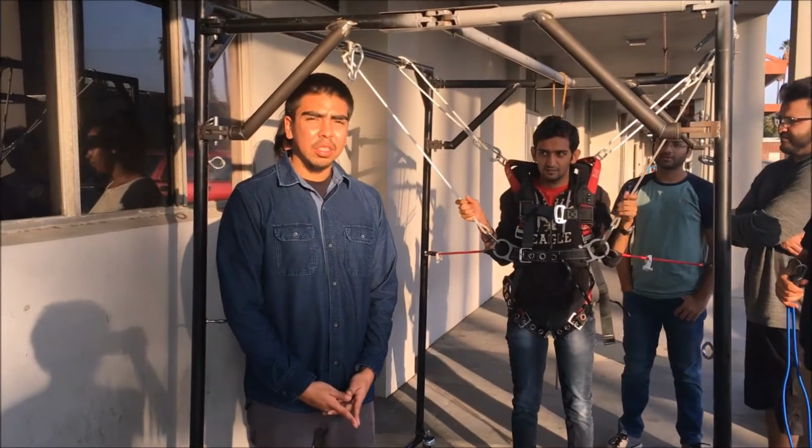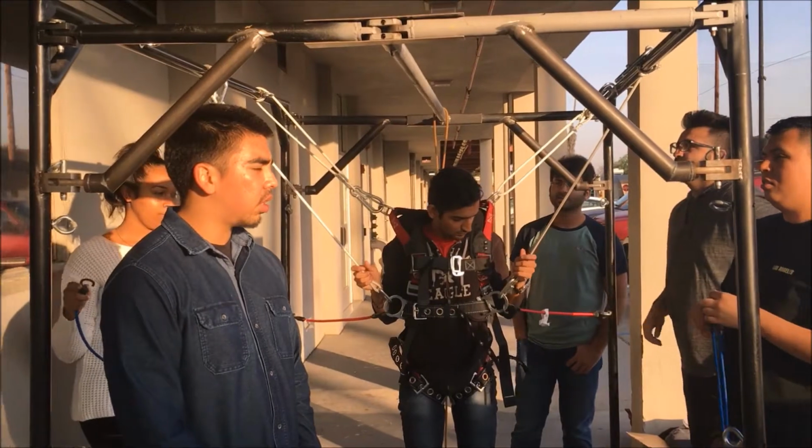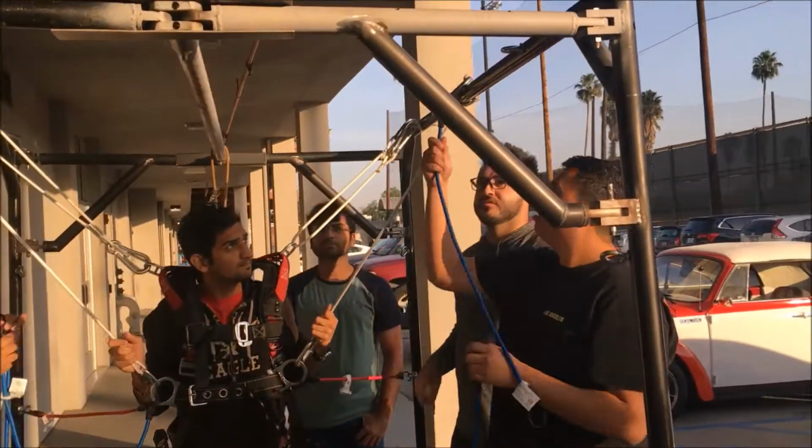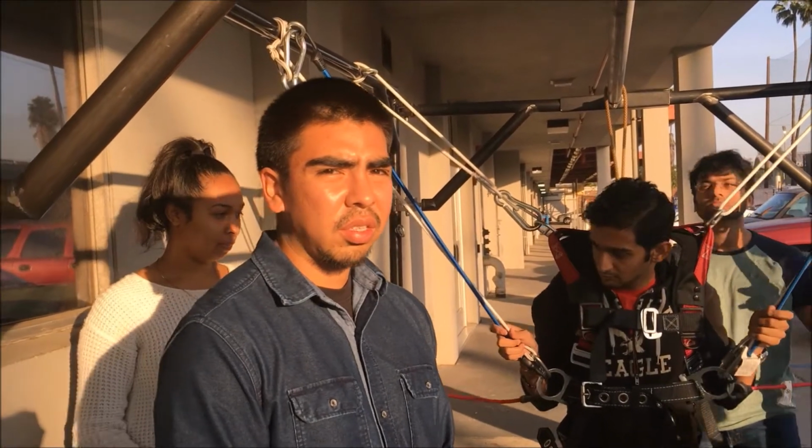A big advantage to the spider cage is that you can adjust the amount of support using the bungee cords. You can keep adding bungee resistance cords.